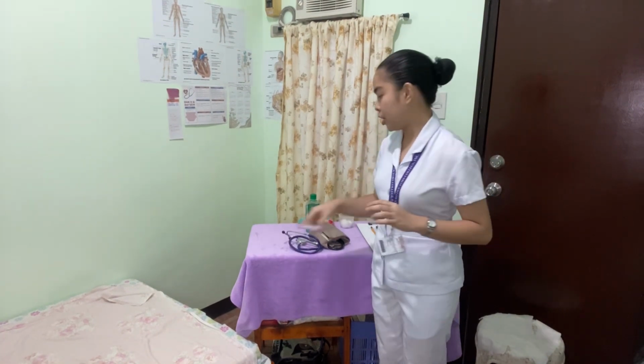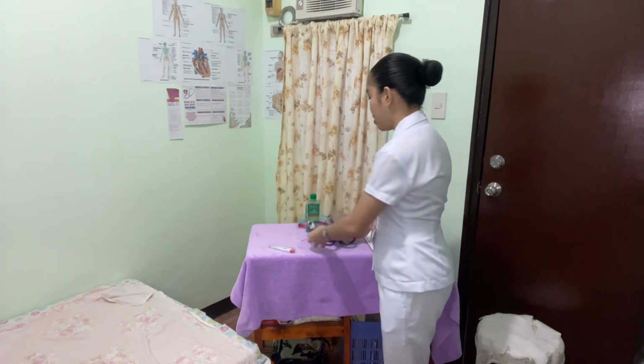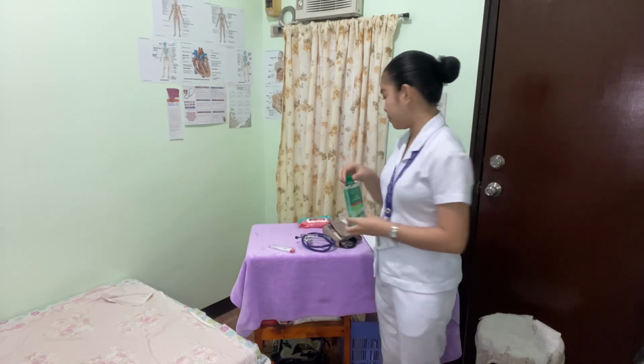Paraphernalia needed are a digital axillary thermometer for the patient's body temperature, a stethoscope and sphygmomanometer for the measurement of the patient's blood pressure, a watch with a swift second hand to measure the patient's pulse rate and respiration rate, and of course, alcohol for disinfection and to avoid contamination.